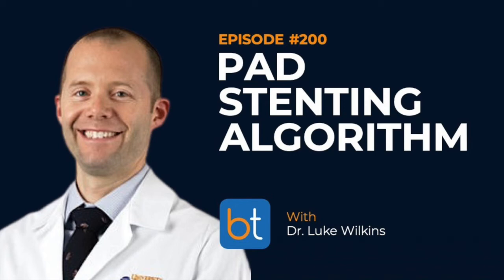So let's say you're successful with your subintimal recanalization. Now, the next step in the flowchart comes down to vessel diameter. Could you speak about that a little bit? Yeah. The medical literature is kind of plus minus on this one, but it's been our experience that larger vessels do well with stenting. So if you're in the stent portion of the algorithm, vessels that are greater than 5 millimeters tend to do better, at least in our experience. So when vessels are greater than 5 millimeters, we feel like the stent patency is better.